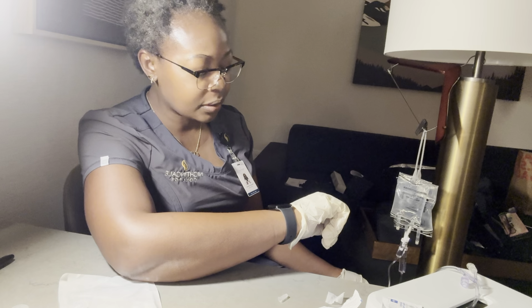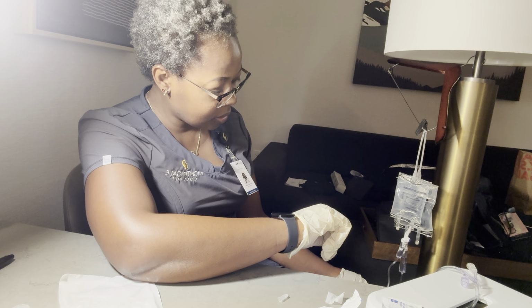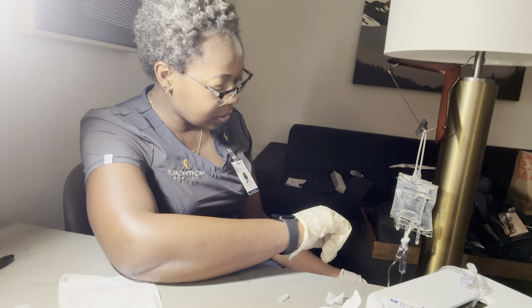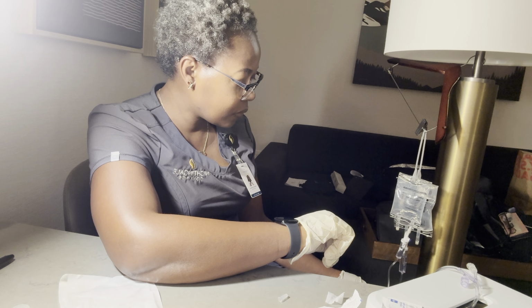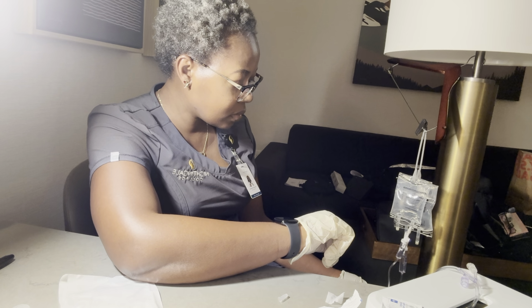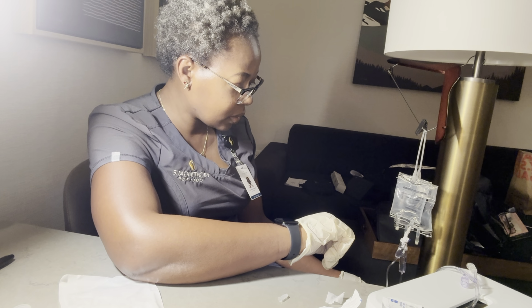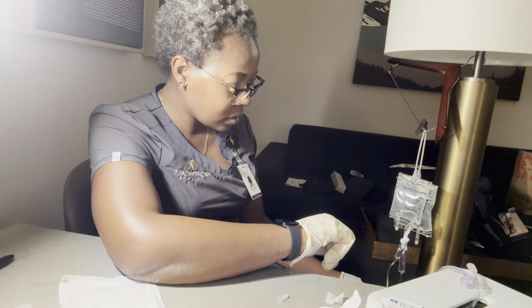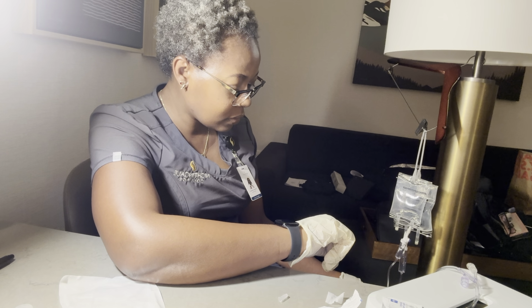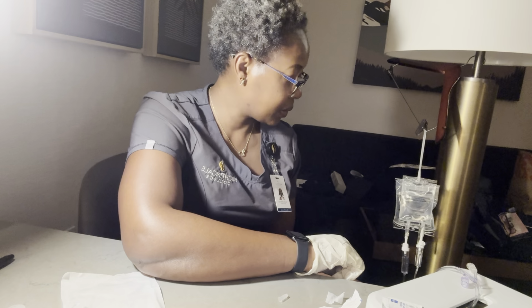Started there. Okay, there you go, start. 100 drops per minute.